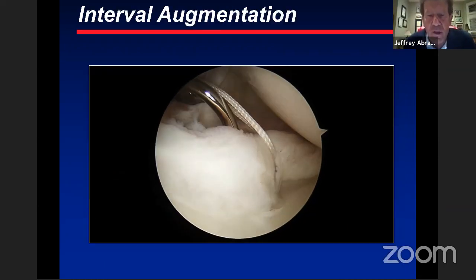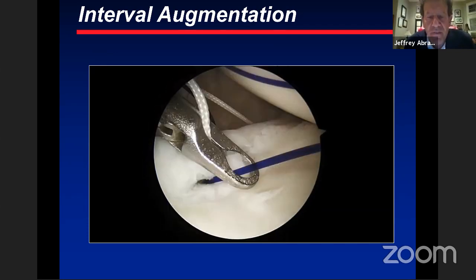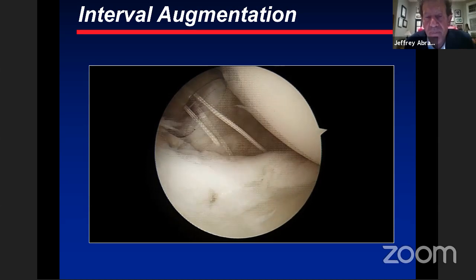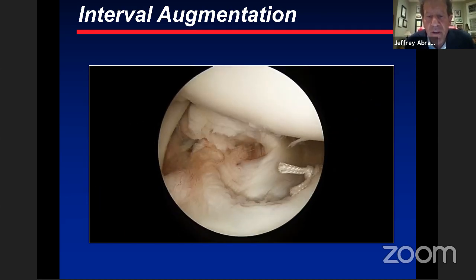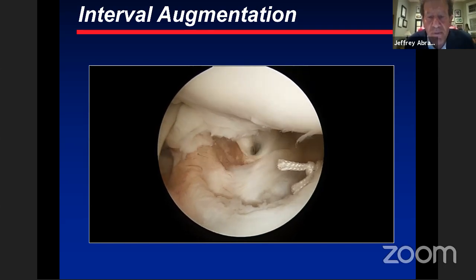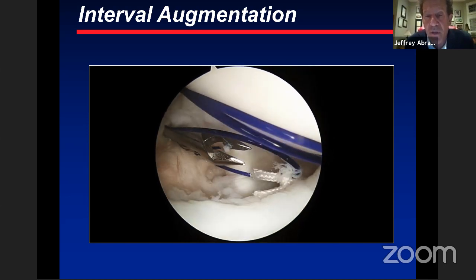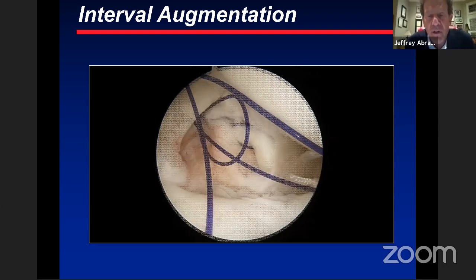Here's a right shoulder in lateral decubitus. I'm putting in my final mattress suture to create tightness of the anterior upper band of the inferior glenohumeral ligament, using a monofilament suture after already completing the inferior portion. I grasp the outside ligament then go through the upper border of the subscapularis, sometimes capturing the upper border of the middle ligament, then through the superior ligament. I do not want to go near the biceps tendon — the idea is not to put tension on the biceps but to reduce the interval along the upper border of the subscap, capturing the coracohumeral ligament.